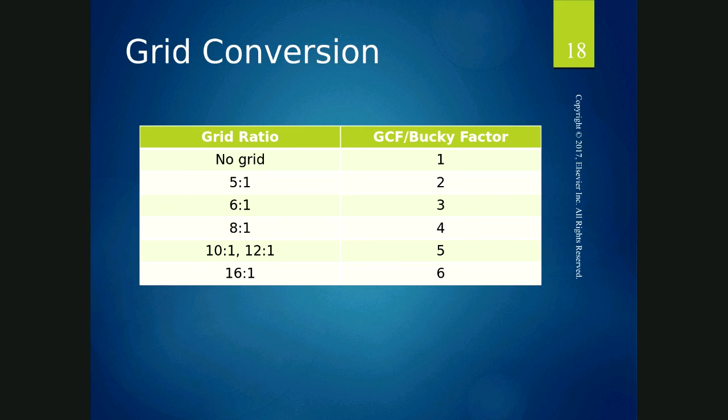So as you increase your grid ratio, you have to increase your technique, and your grid correction factor tells you that. I will tell you that you have to know these. You will have to know them from now until forever. You'll have them on every clinical exam that you ever have. For me, you'll have at least one grid correction factor question. So learn them, love them, live them, commit them to memory. These are important, okay?